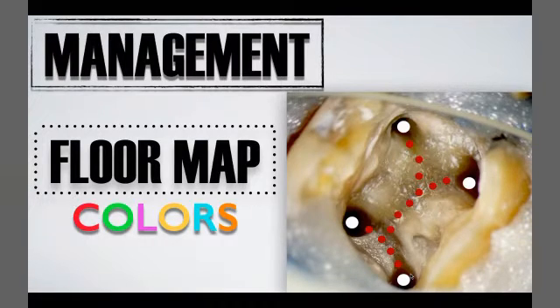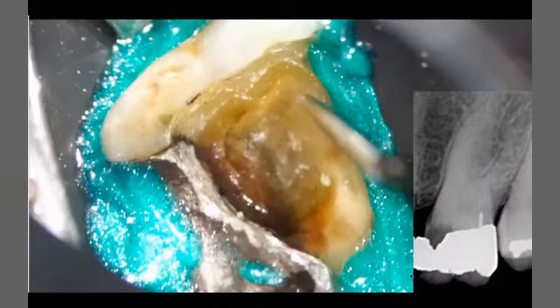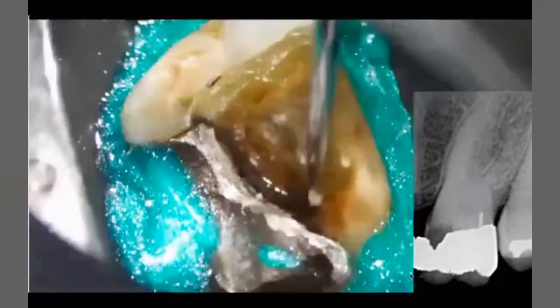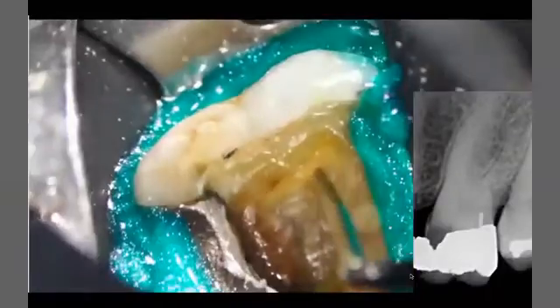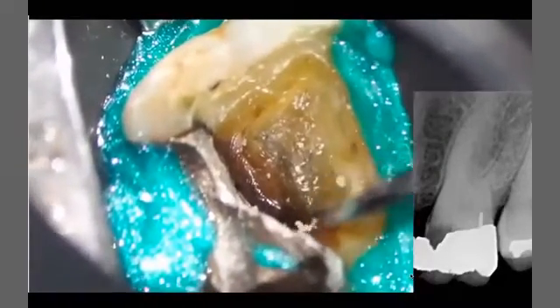Go ahead. So now to the second case or clinical situation for the calcification. We can see in this upper molar we have a sclerotic dentine. We have no pulp stone here. In such cases, according to the last question, we have to use magnification. We have to use a microscope, because loops cannot do anything here.